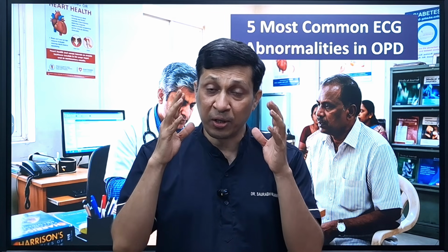if you could easily recognize these ECG patterns, it will tremendously improve your OPD practice. So friends, today's video is very important.